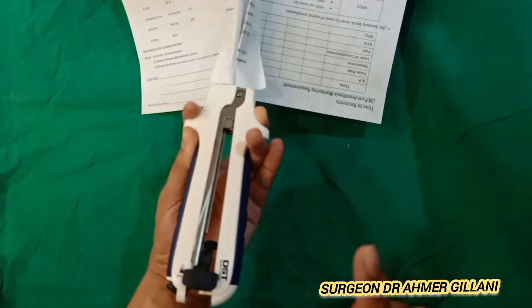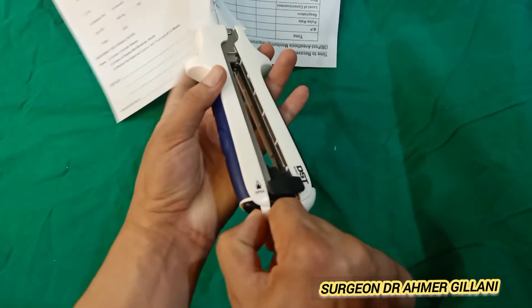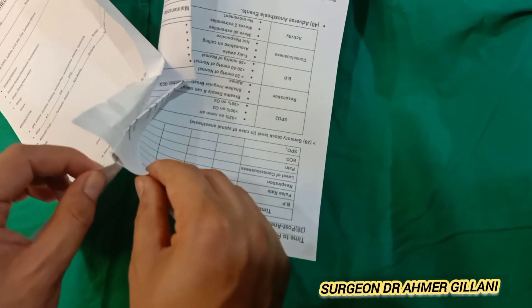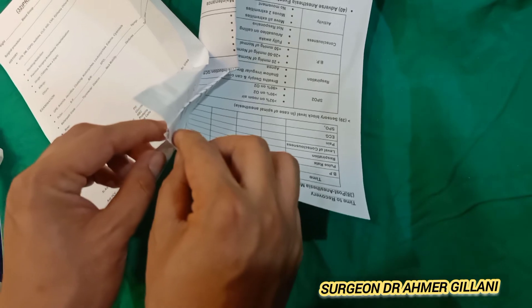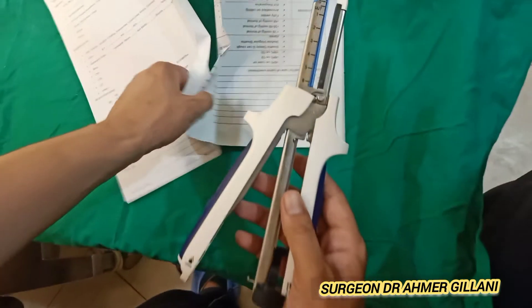Again you will wait, and after that you will open it using this button. Finally it has been done. Then you will check for the patency and the approximation of your stitches. This was all about the linear stapler — hope you have understood something from this video.